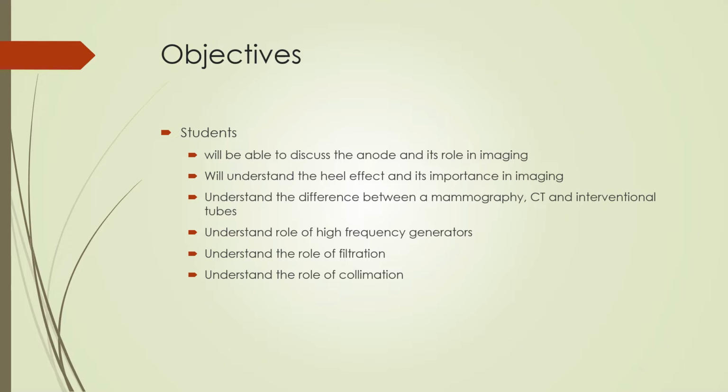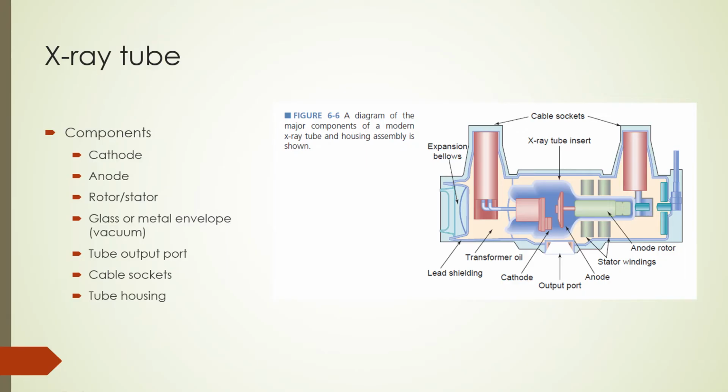We will learn the differences between a mammography, CT, and interventional tube, and we will learn about high-frequency generators and understand the role of filtration and collimation in imaging. I will start with an overview of the X-ray tube assembly.